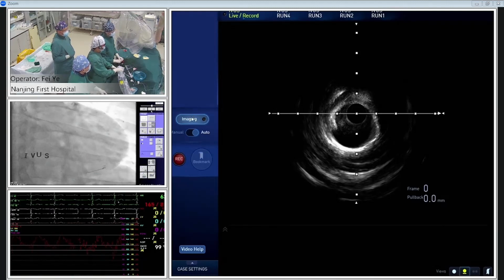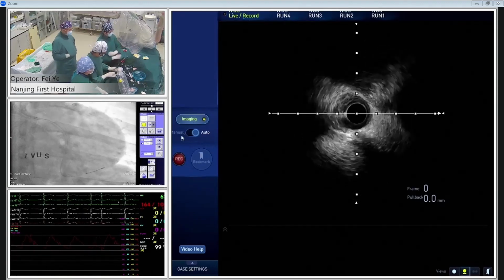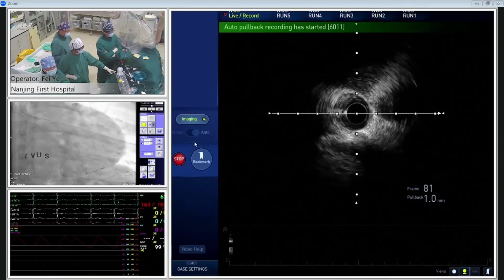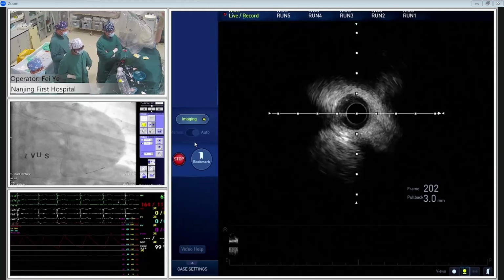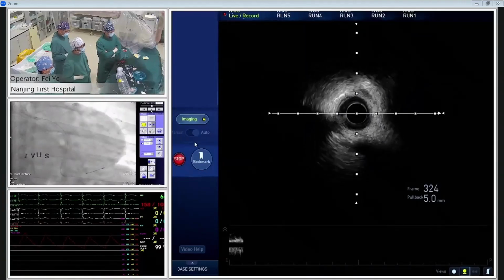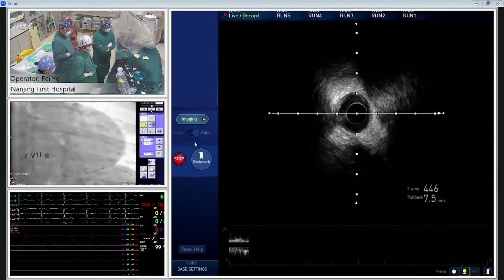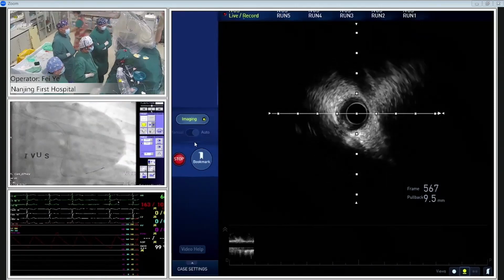Oh, more. Give me more. Nice. Okay, I will pull back. So the distal vessel was too small. Yeah, less than 2.0, circumflex. It's a CTO lesion. Maybe three months later, the vessel will enlarge due to the blood infusion.